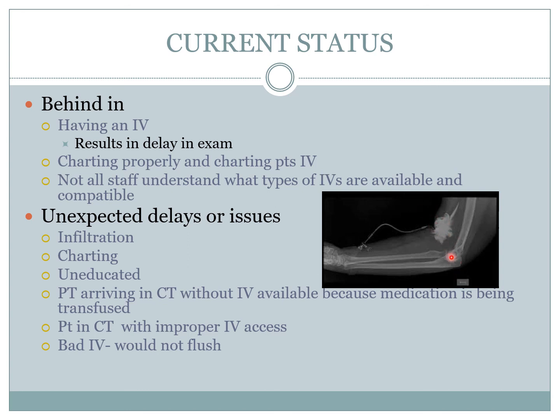When there's an extravasation, never put an IV below that extravasation. There's no free-flowing blood contrast that's going to go through. So when there's an extravasation there, or there, or there, or there, you go higher. You put in an IV higher than that. So never go under the extravasation, always go over the extravasation.